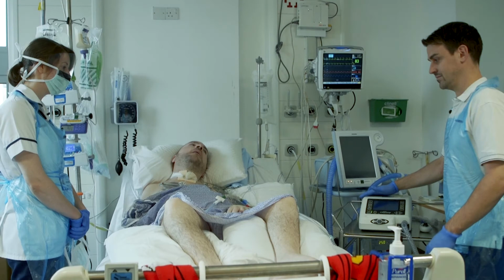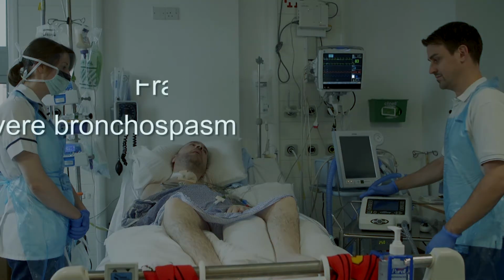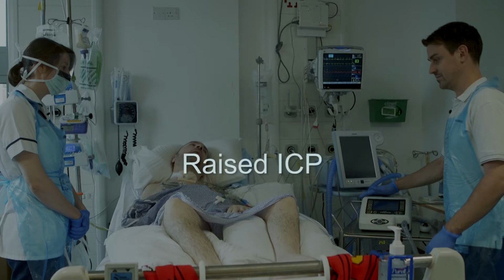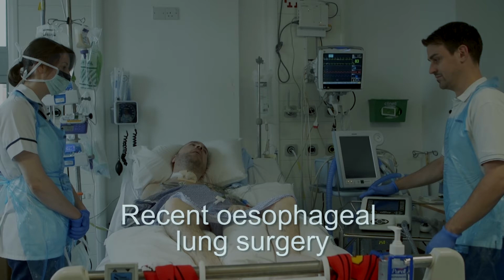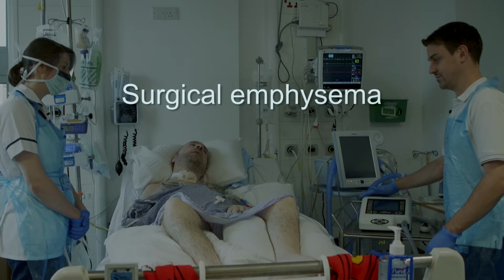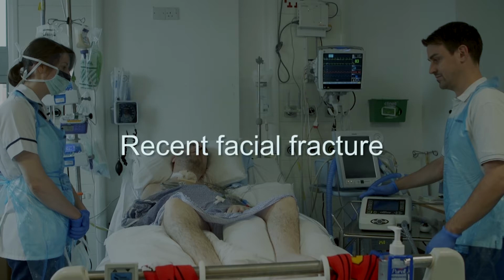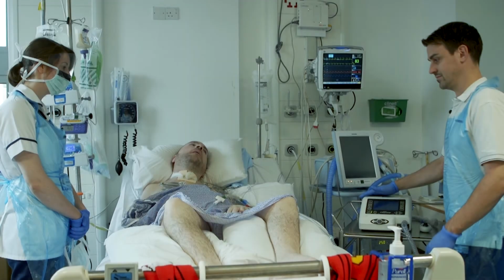The potential contraindications and precautions are related to positive pressure and include an undrained pneumothorax, haemoptysis, severe bronchospasm, raised intracranial pressure, recent oesophageal or lung surgery, cardiovascular instability, surgical emphysema, recent facial fractures if you're using a face mask, and proximal tumours, although you may discuss with your consultants the risk-benefit for treatment.